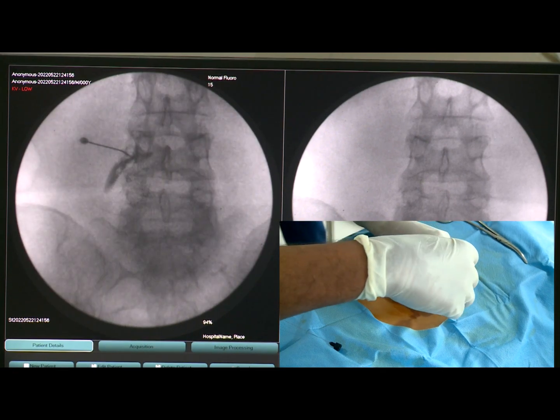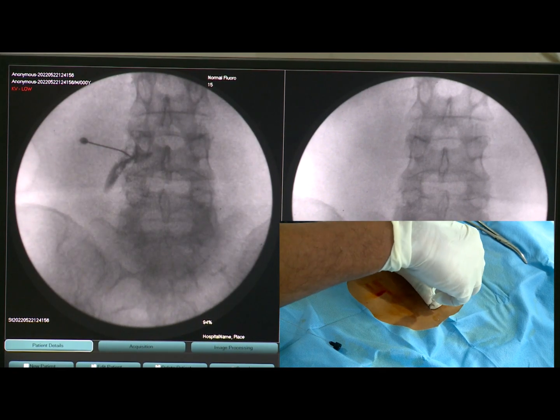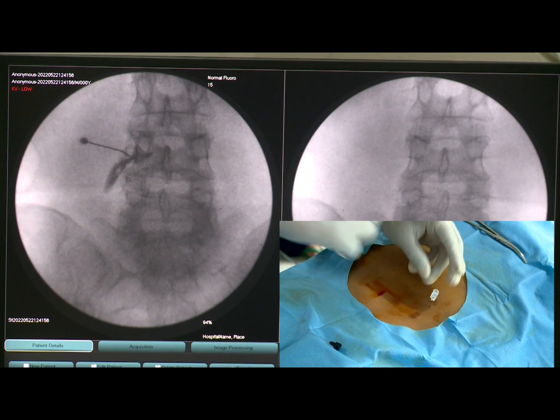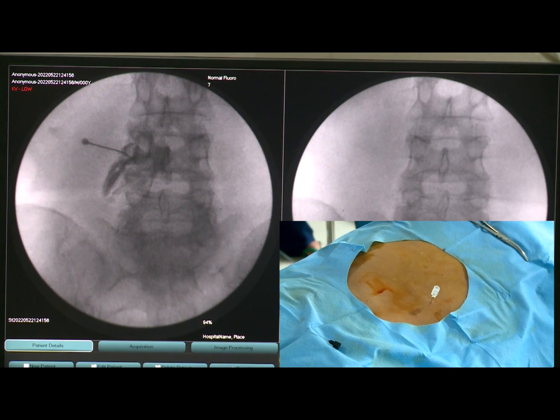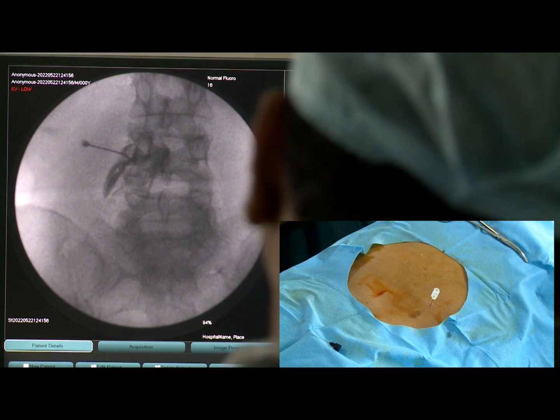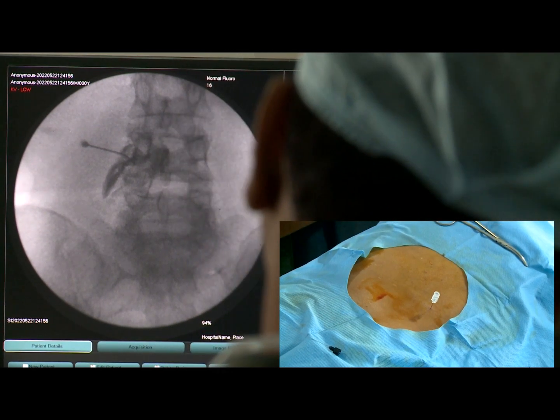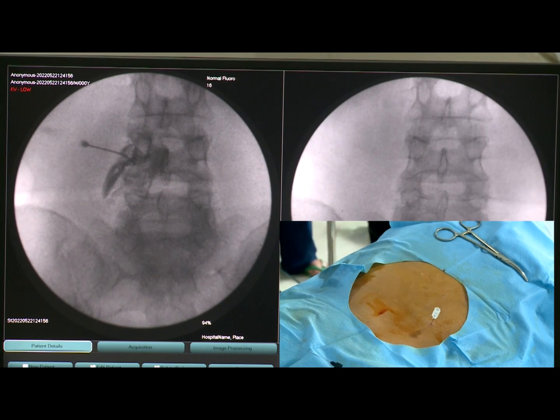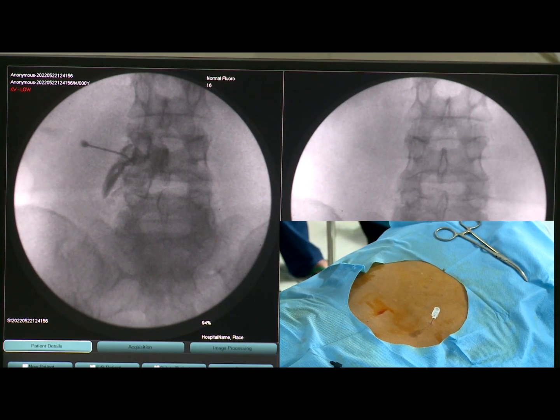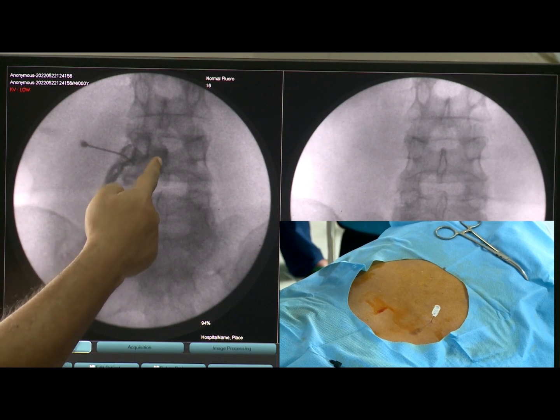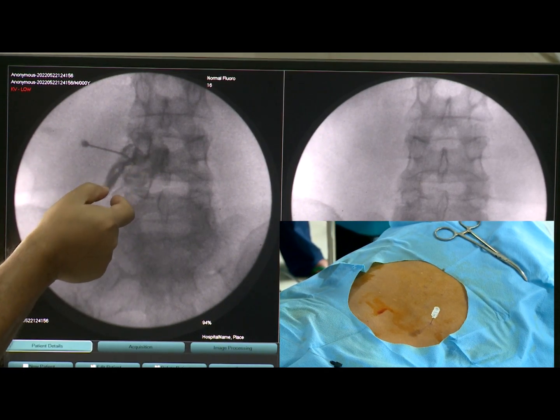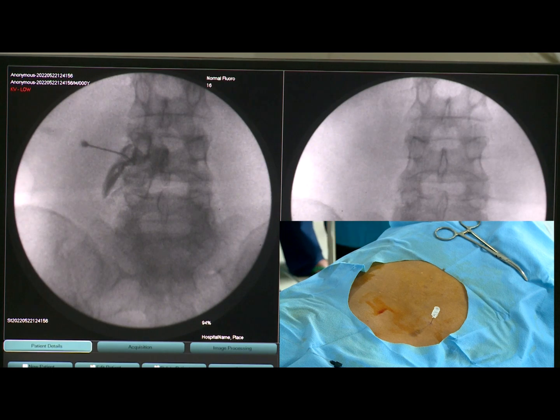You can see the dye is now also coming along the traversing nerve root. The traversing L5 nerve is also a little bit visualized, and you can see the dorsal root ganglion.